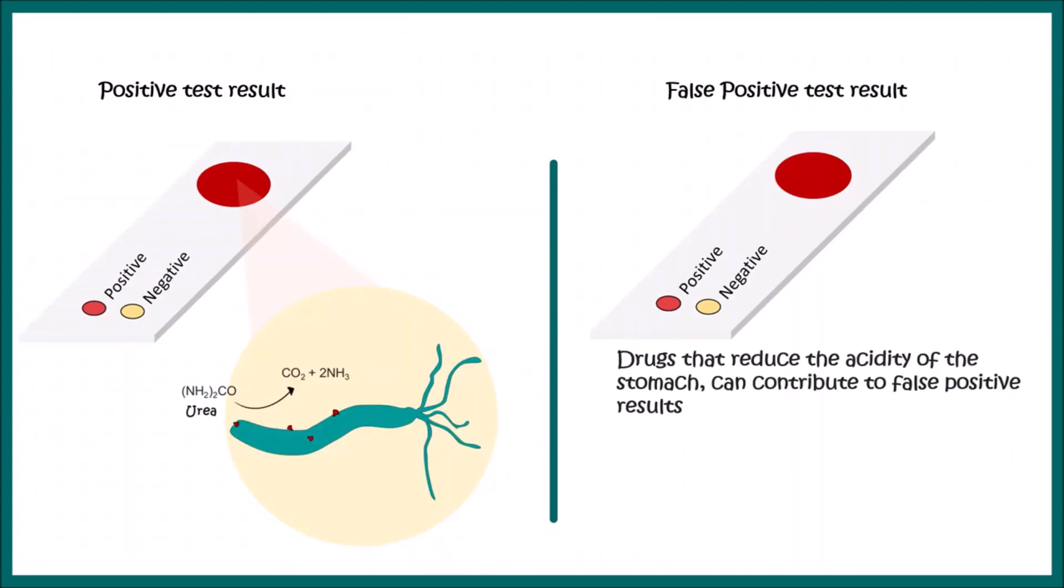Let's try to understand false positive results. Sometimes you see red color formation, but it doesn't always ensure your test result is positive. If you're consuming a drug that reduces the acidity of the stomach, that can possibly contribute to false positive results.